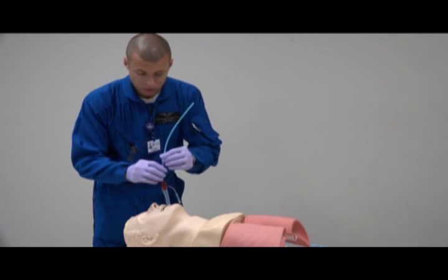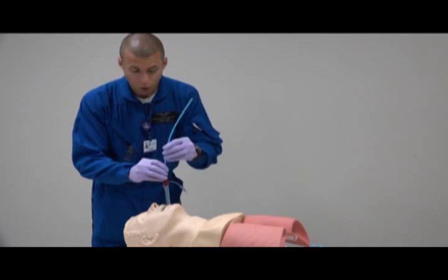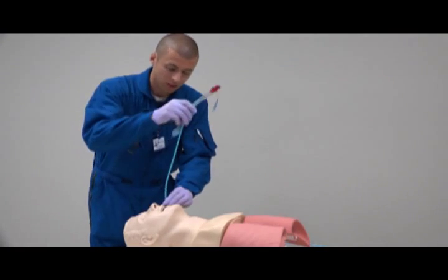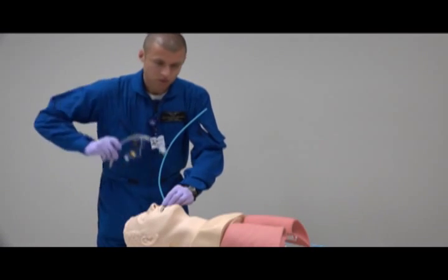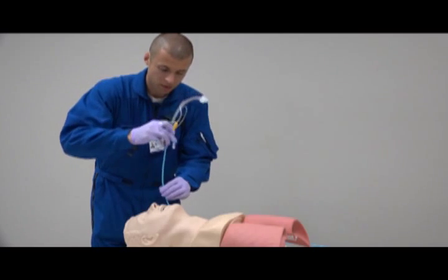Once you feel like you're in the trachea, always make sure you hold onto your gum bougie. Slide your King out and feed your endotracheal tube onto the gum bougie.